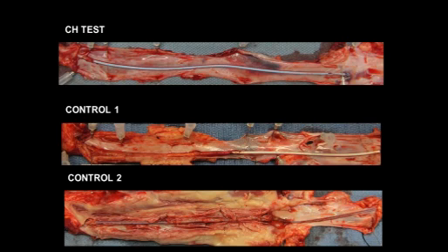Now, one thing, these studies were done in the jugular vein, and the reason why they were done there was to eliminate the many intervening variables that occur when catheters are placed in the arm. In this case, we were asked to evaluate the effects of the surface coating. And so to remove those variables, we placed them all in a larger vein that would not have the intervening variables. We did do a PICC study with these catheters in the leg, and this data is going to be presented at the SHEA conference.